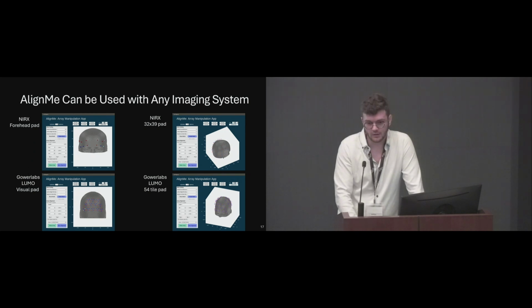Another cool thing about NeuroDOT and AlignMe is that we're system agnostic. It doesn't matter if you have an Artinis, NIRx, Lumo, or home-built system. We can work with all of them.